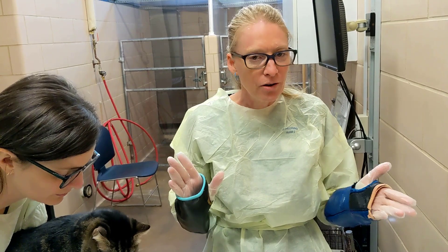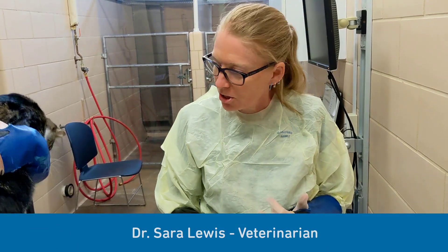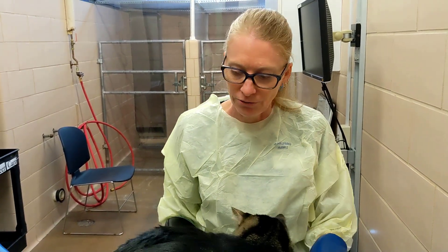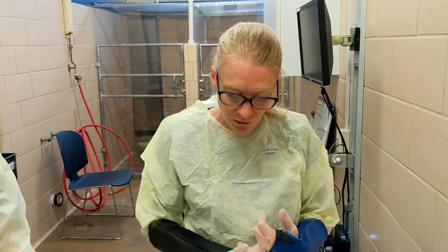Today we're going to talk about pulling fur for a culture for potentially ringworm, and also plucking fur around the potential lesion for ringworm and sending it out to the lab for PCR. We want to make sure we do this before we lime sulfur dip the animal, because lime sulfur negates the whole process and nothing will grow. So we want to make sure we're plucking and pulling fur cultures before the lime sulfur dip.